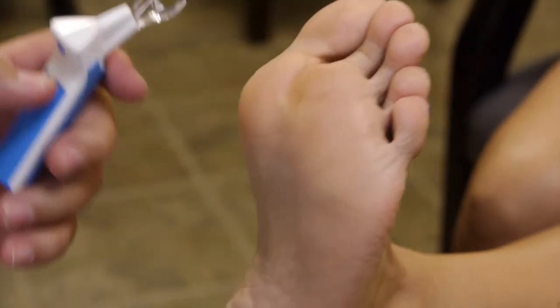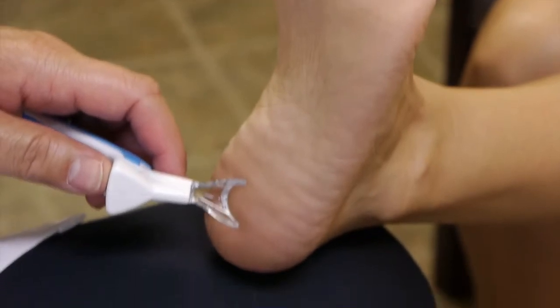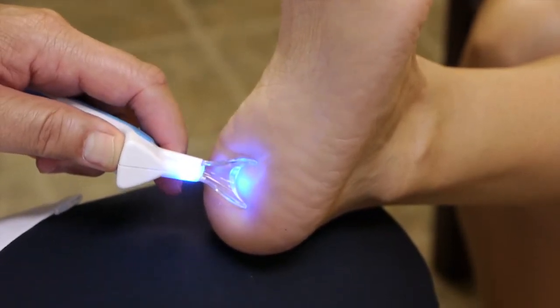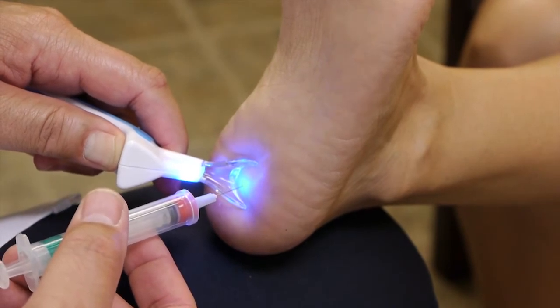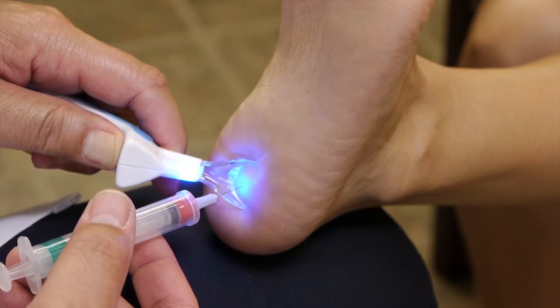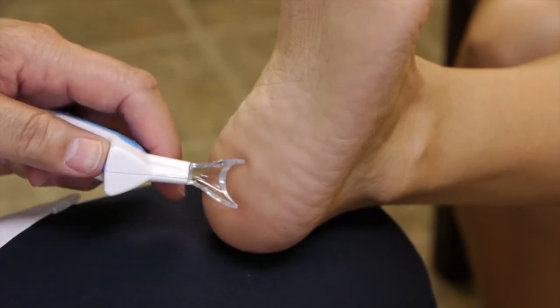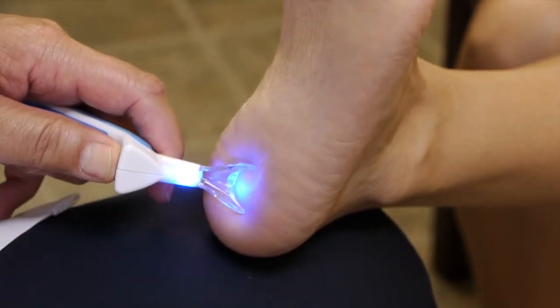This could also be done if I were to do a plantar injection directly into the calcaneus, which some people still do, directly into the plantar fascia. And I've used this several times on people where I literally push the needle all the way to the bone, back off just a little bit, and then infiltrate the medication. They do not feel the needle going in. They do feel the medication, but the sensation is considerably diminished using the vibration device.